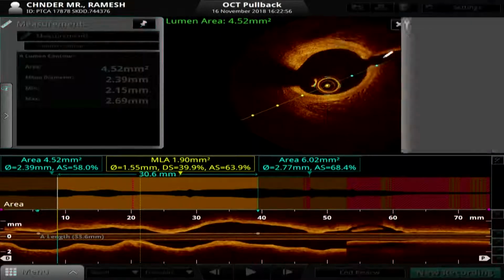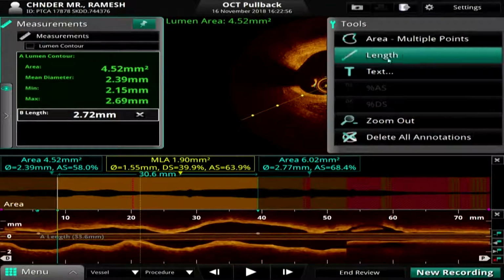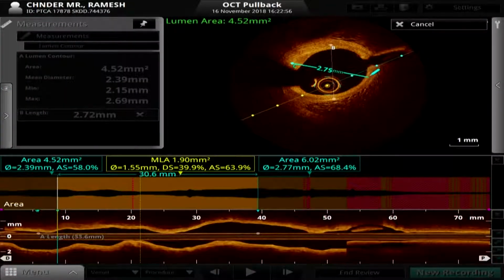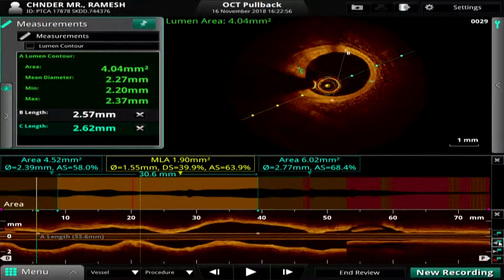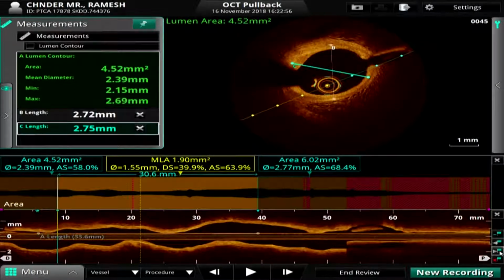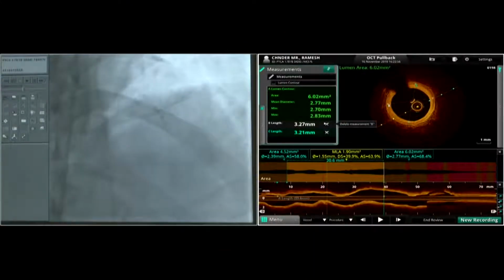Be careful calculating these, number one, to size appropriately, number two, to land in a proper, healthy distal bed. And you'll see in the next lecture, if you do this correctly, you really can accurately place any stent with really very good durable long-term results, I think. And this is what the next speaker is going to show. So we are about to start.